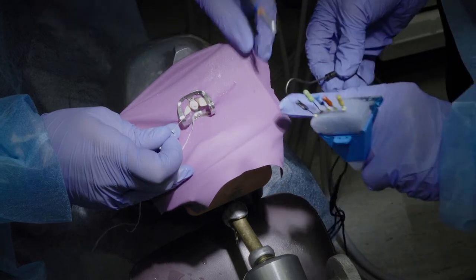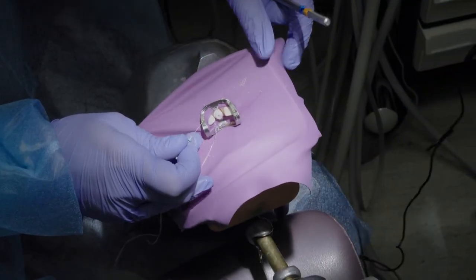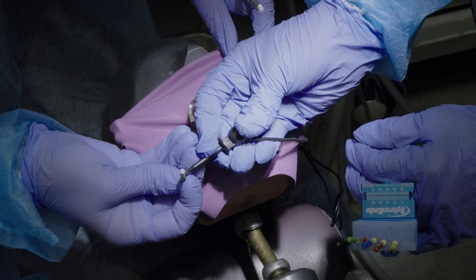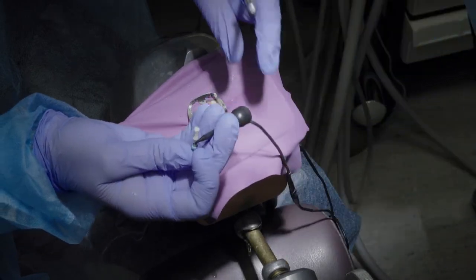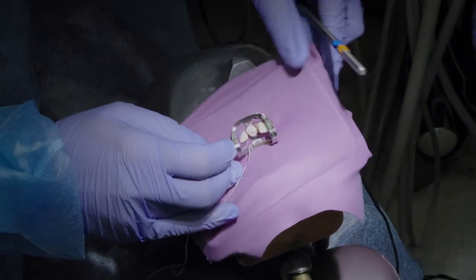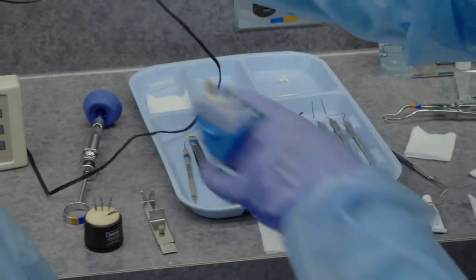The assistant will place the grounding hook on the patient's lip. And the apex locator is then clipped on to the number 15 file. The assistant will remove the apex locator grounding hook.